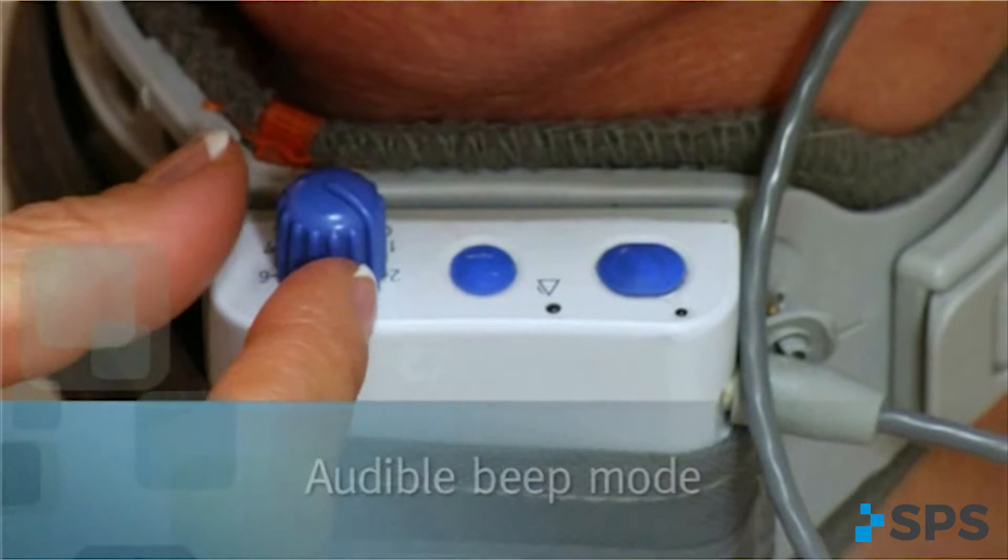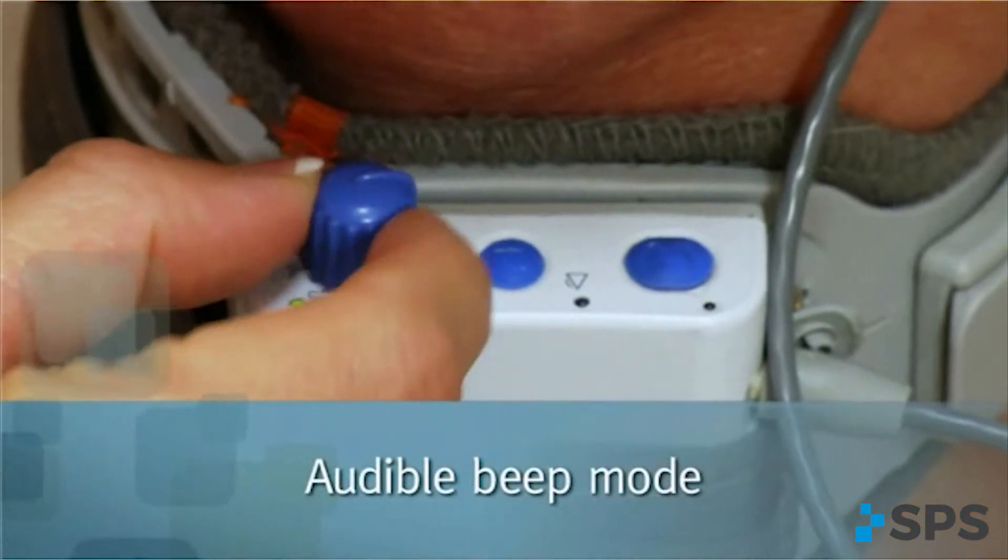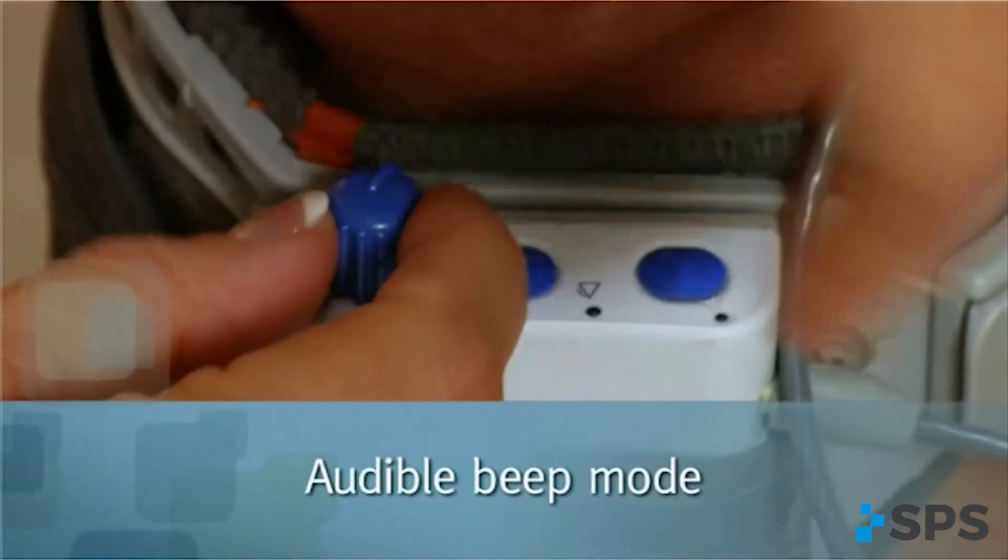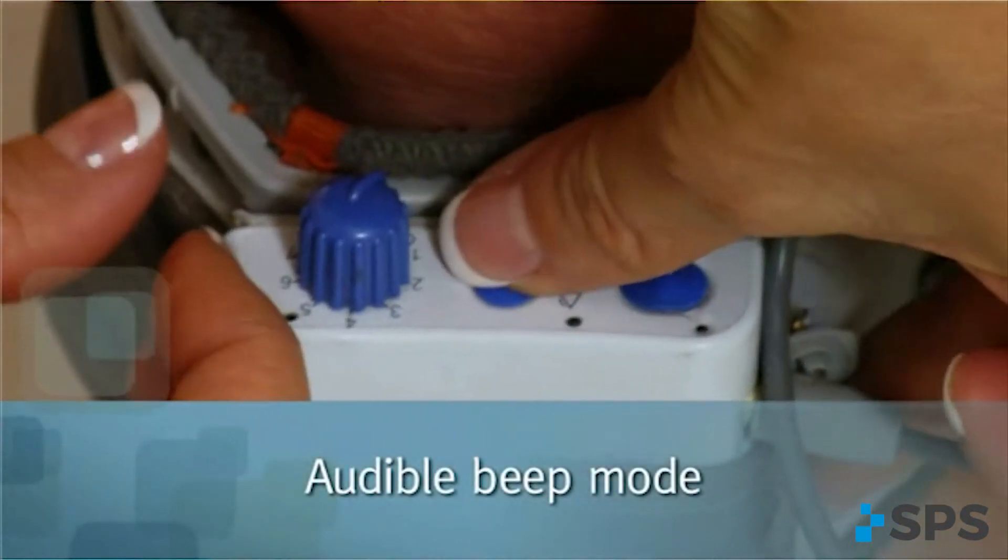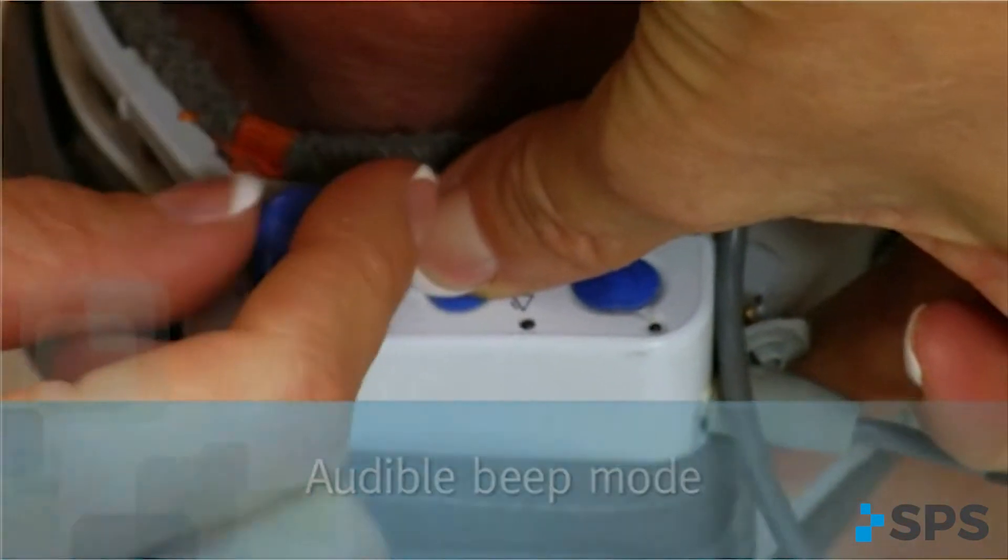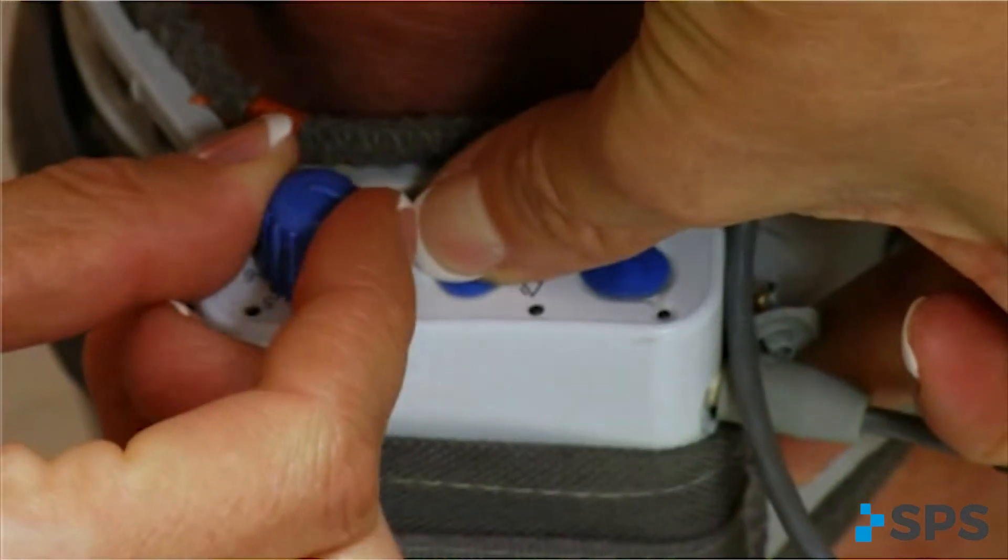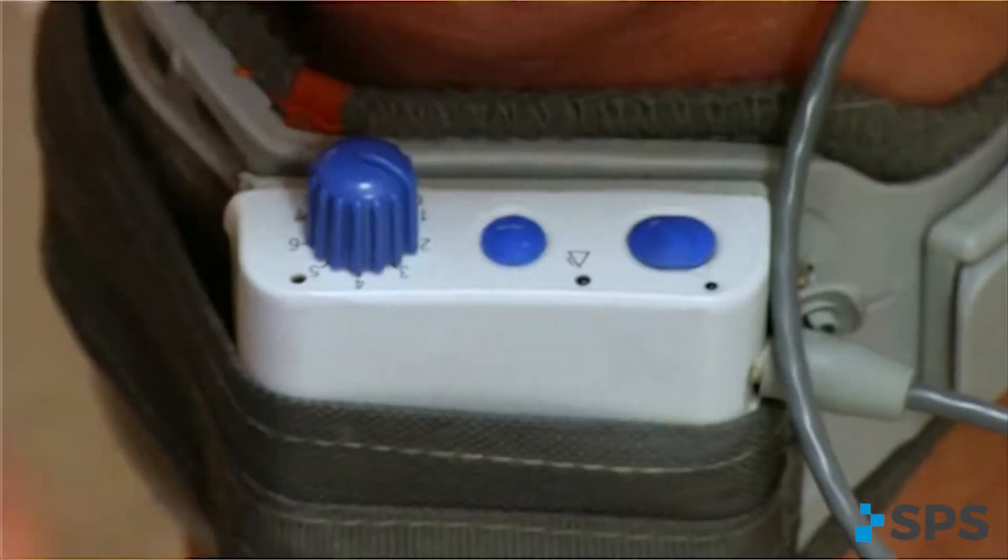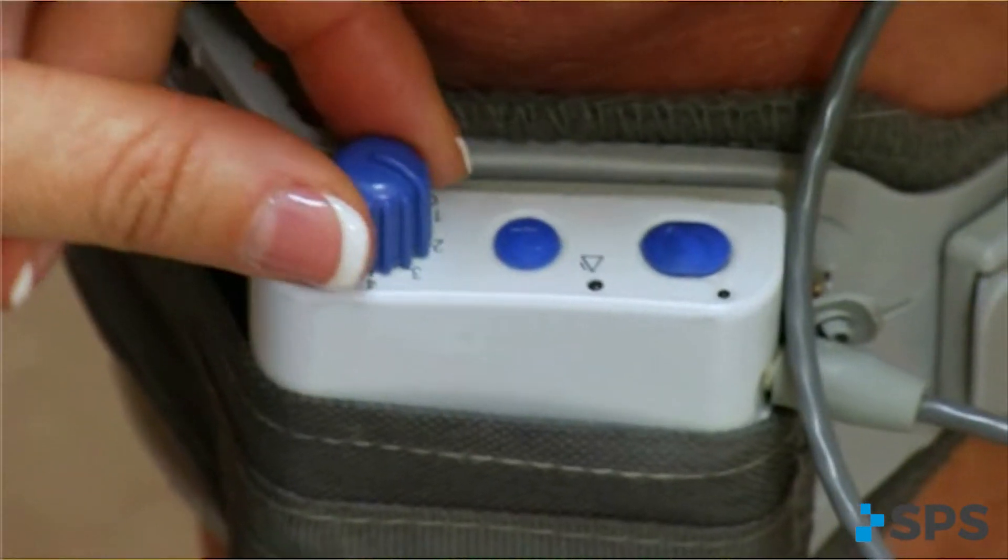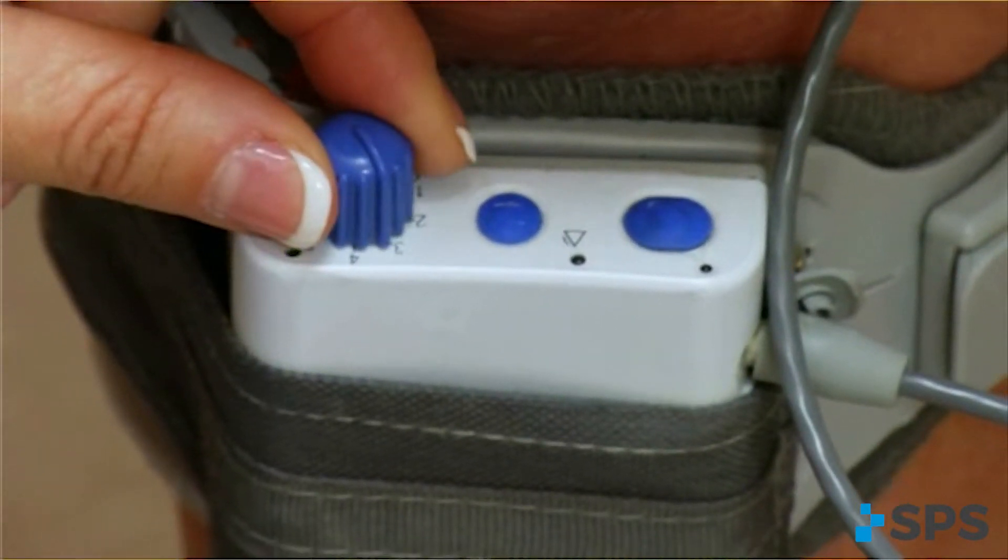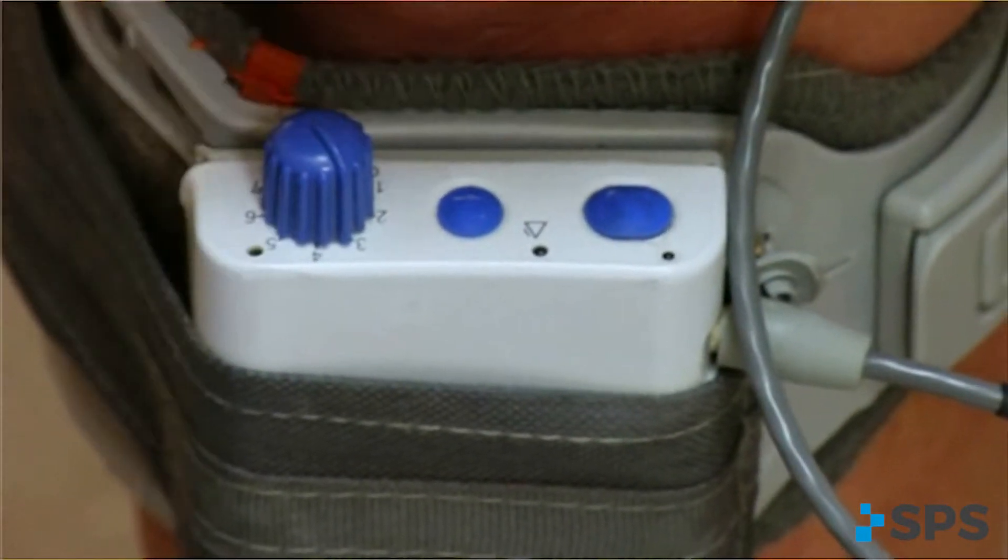To set the audible beep, start with the WalkAid powered off. Depress the middle blue button on the WalkAid while turning the WalkAid on. Release the button immediately after hearing the beep that indicates the power is on.